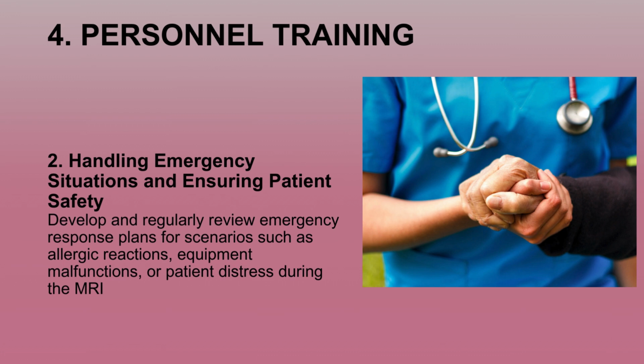Handling emergency situations and ensuring patient safety. Develop and regularly review emergency response plans for scenarios such as allergic reactions, equipment malfunction, or patient distress during the MRI. Conduct regular drills to simulate emergency situations and assess personnel readiness. Establish communication protocols to ensure quick response coordination among MRI staff, emergency responders, and other relevant healthcare professionals.